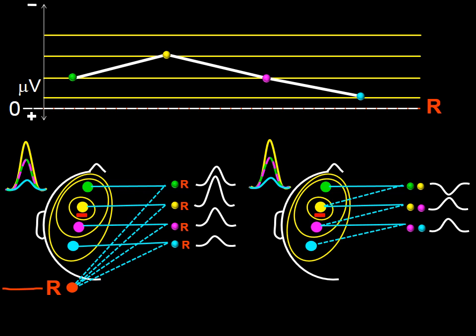Now I have introduced the same potential but using a common electrode reference montage to evaluate them. In this case, I have placed the reference at a neutral point. Notice that the waves from the fictitious neutral point have not changed when compared with the ones previously shown.